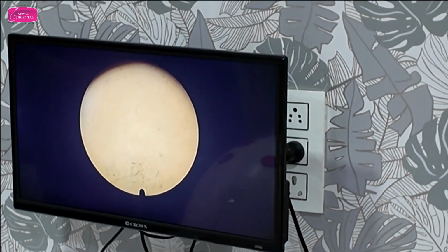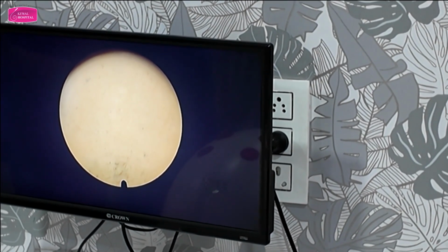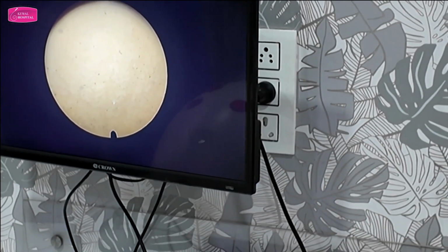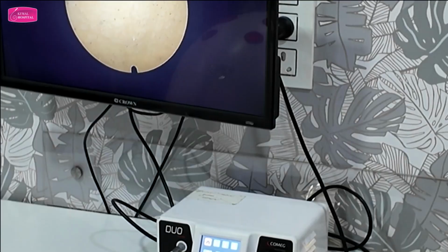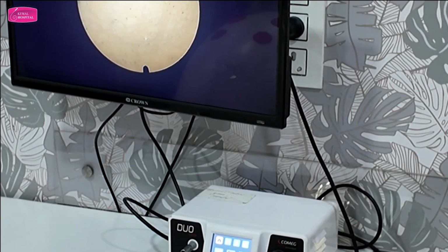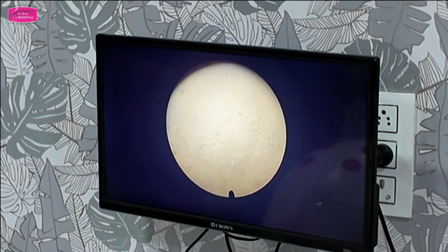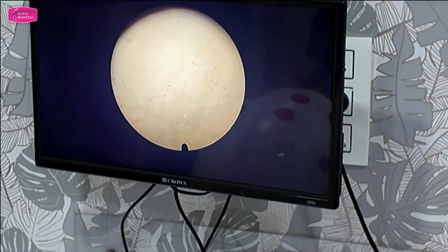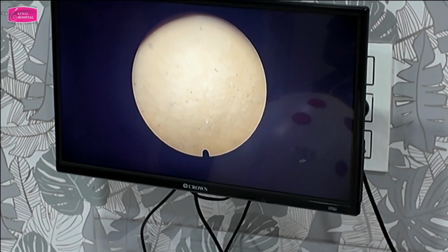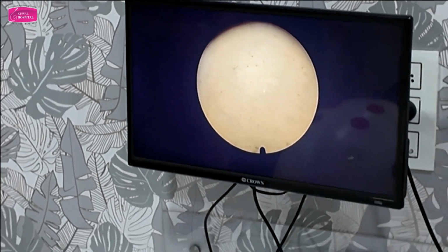Suppose there is polyp. So what I will do is, I will introduce the scissors from here. See, you need assistant. See, these are very delicate, so most of the fellows damage this. So we don't replace it because these are very costly. So this is just for mimicking. So remember, my assistant, I will be holding this and this. My assistant will guide me.